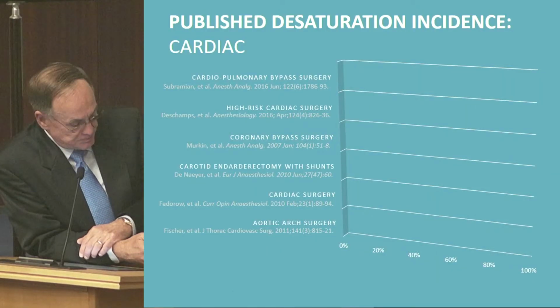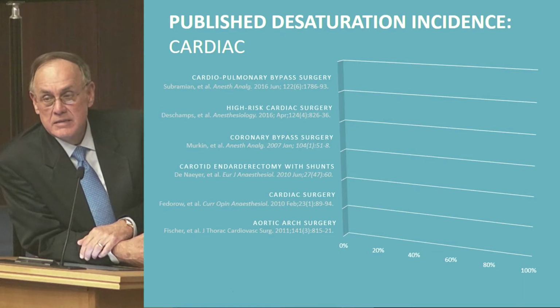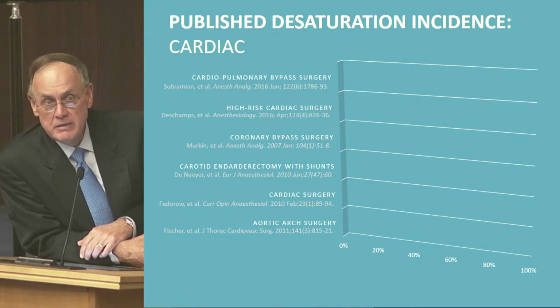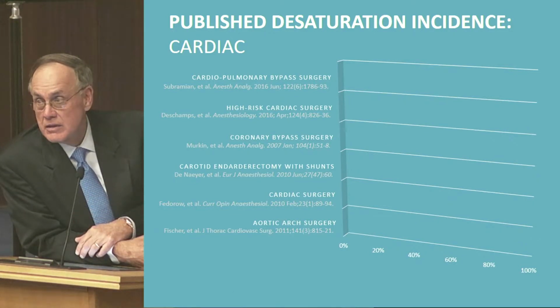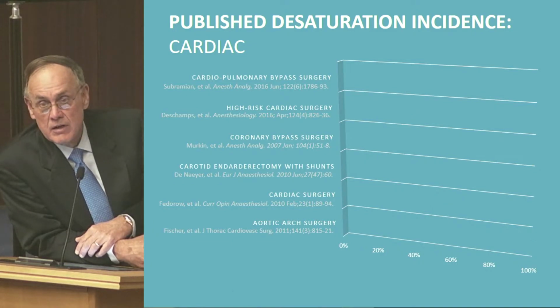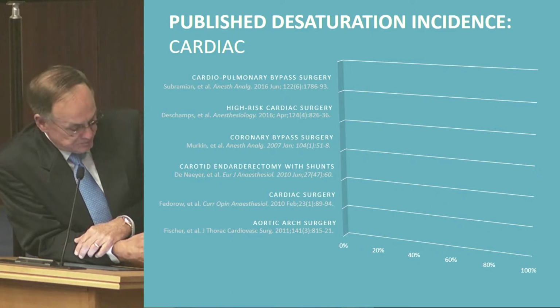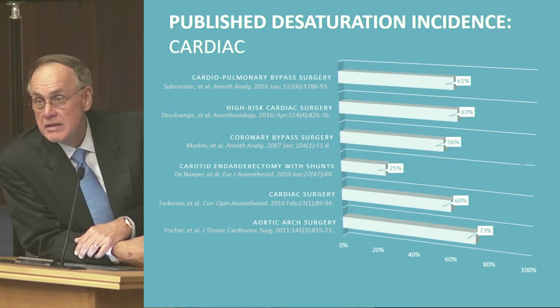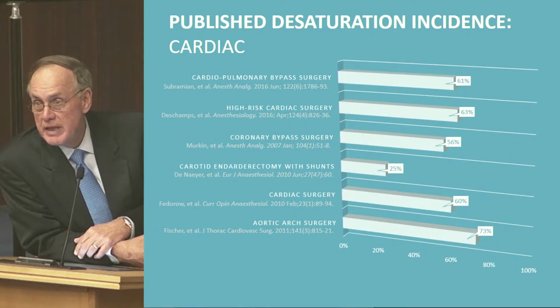Okay, so do these cerebral desaturations actually happen during surgery? Well, the technology was developed in cardiac surgery, and so we looked at the literature in cardiac surgery. You can see all the different cardiac surgery procedures here. And indeed, a significant number of patients do experience cerebral desaturations during surgery.